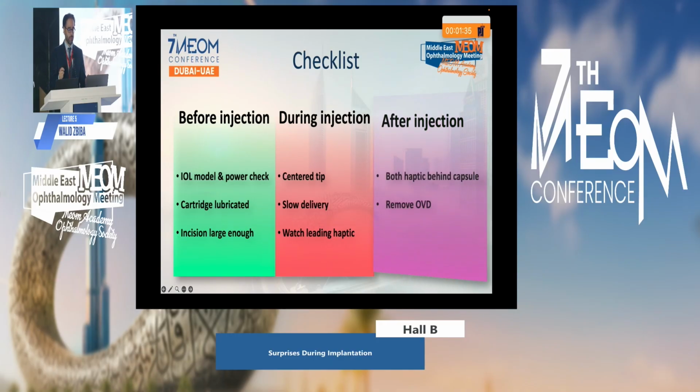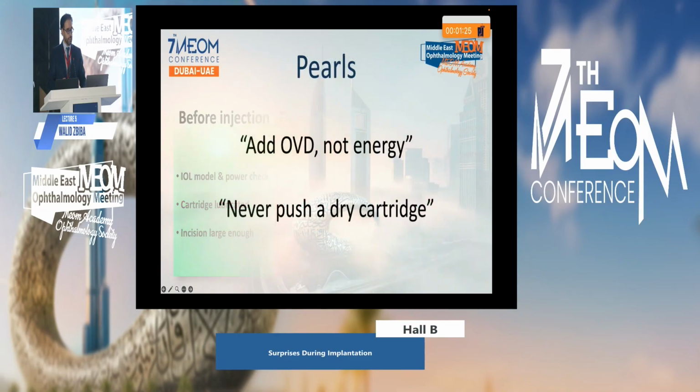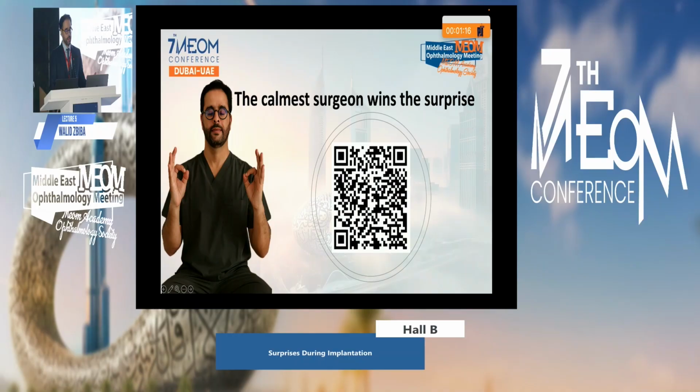After injection, we have to place both haptics behind the capsule and remove OVD from behind the IOL. And really, we have to add OVD, never energy, never push a dry cartridge. And at the end, a calm surgeon wins over the surprise.